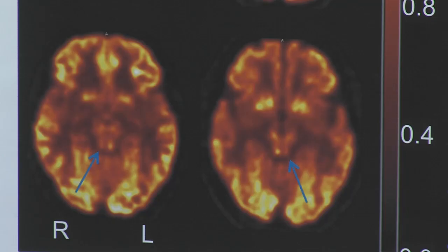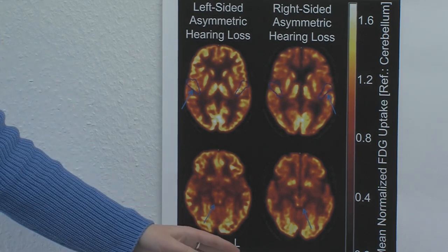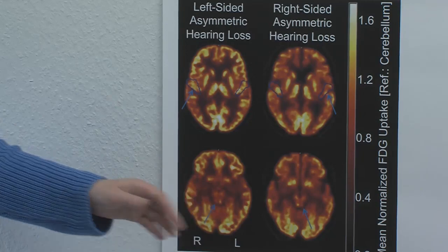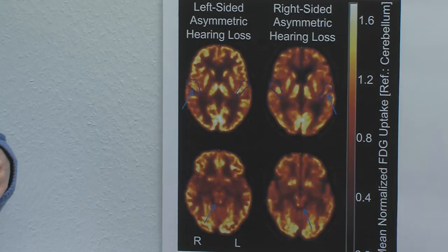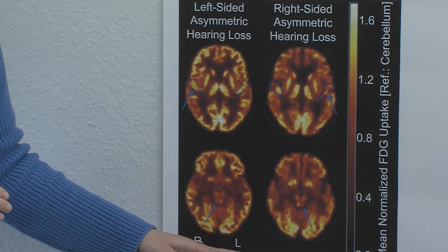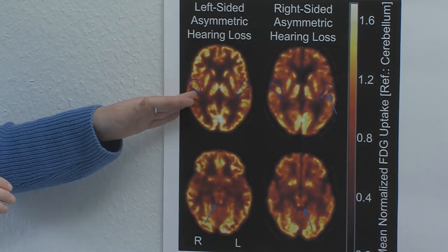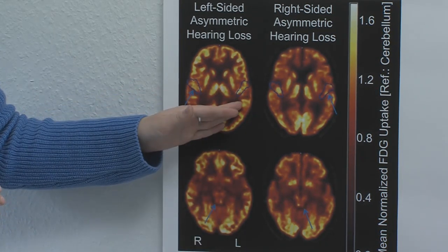Therefore we have to look on the contralateral side, to the left side, to see the impact on regional FDG uptake by the deaf ear. At the level of the brainstem, we see an asymmetry between the ipsi and contralateral side to the deaf ear. There is less regional FDG uptake contralateral to the hearing-impaired ear on the left-hand side. The same asymmetry can be seen at the level of the cortex — contralateral to the left deaf ear, we see less FDG uptake in the primary auditory cortex compared to the ipsilateral side.